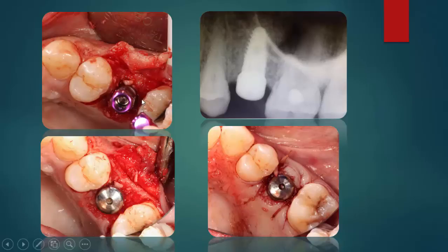هون بنلاحظ الصورة أثناء الإمبلانت بليسمنت. طبعا حطينا احنا also bone graft ضمن الأوستيوتومي، ودفشنا البون جرافت بالزرعة. بنلاحظ الزرعة كيف محاطة بالبون جرافت مثل ما ملاحظين على الإكس راي. And this is after the suture.